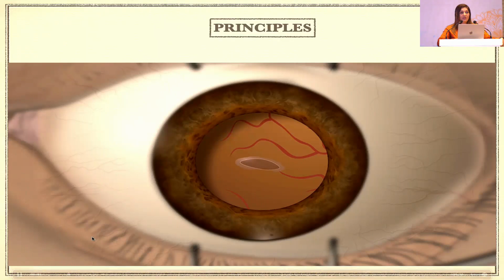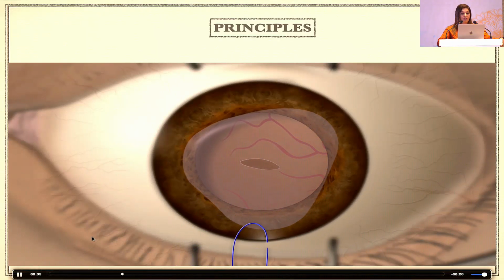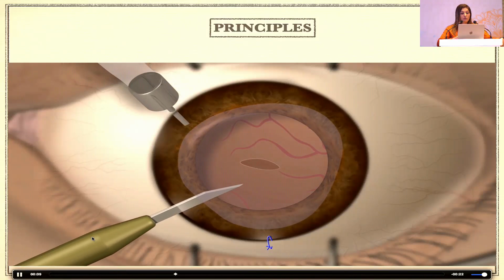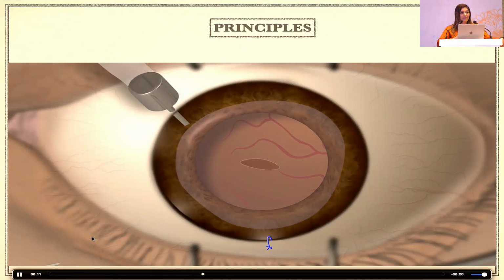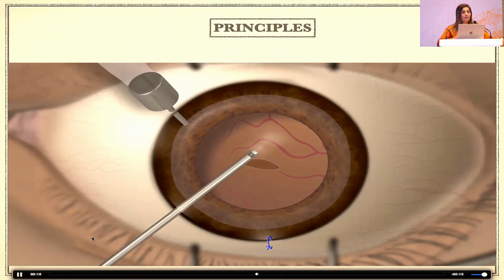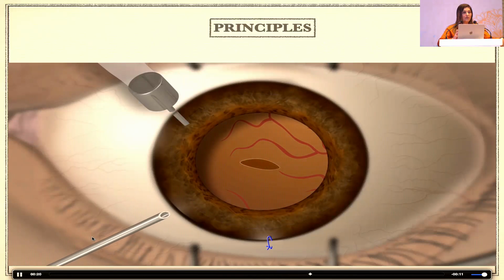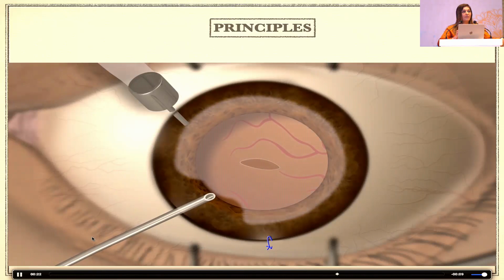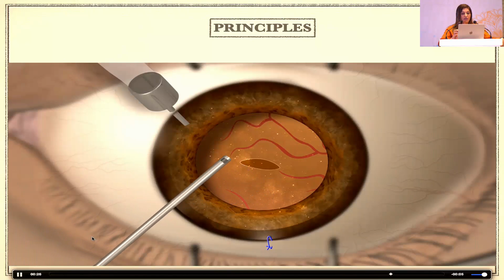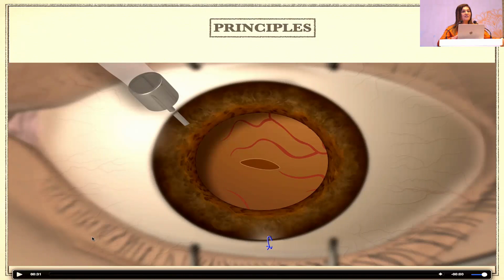If you have a small posterior rupture, as we showed initially, and you have vitreous coming up into the anterior chamber, one of the most important things is to seal up that corneal incision, make a side port, and have a fluid. Here, if you have a small PCR, I would not recommend it if you're not very well versed with vitrectomy; at least do something in the anterior vitreous, cut off those small streaks which are coming up into the anterior chamber, put in triamcinolone, see how much vitreous is out there, and you can just clear it off.